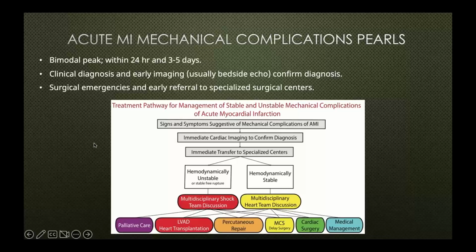As I mentioned, having good clinical skills at the bedside raises your clinical suspicion for these conditions, and you can make the diagnosis clinically, but having bedside echo confirms the diagnosis and can help you make an early referral, which improves survival. And these are surgical emergencies, so when possible, these patients should be referred to a surgical center, and the surgical teams should be informed and involved early on.